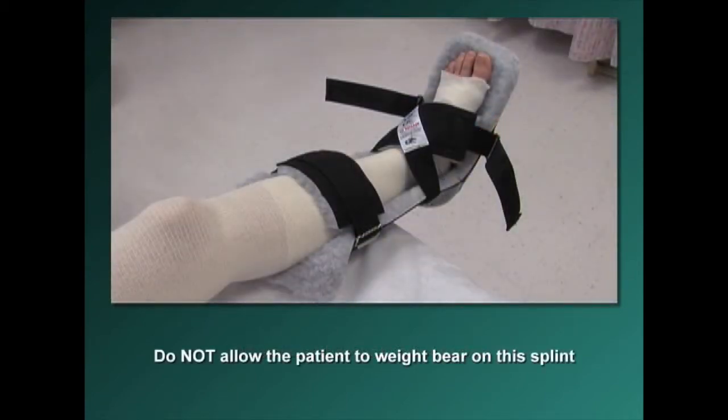Do not allow the patient to weight-bear on this splint, as it is extremely dangerous and slippery.